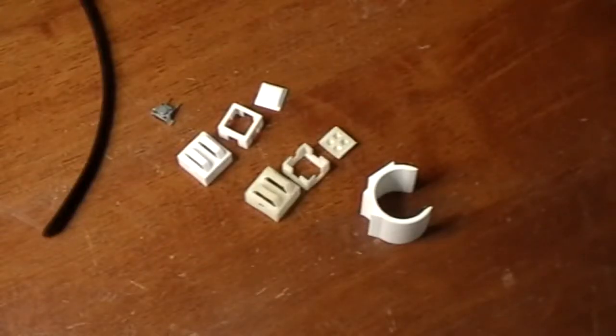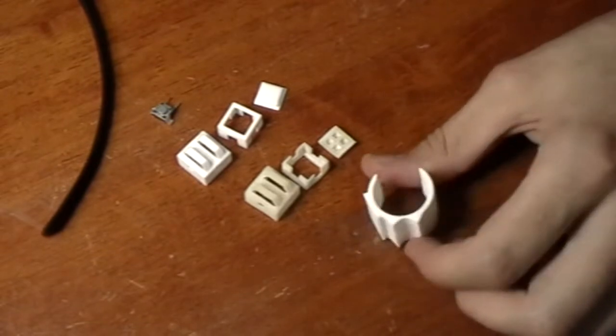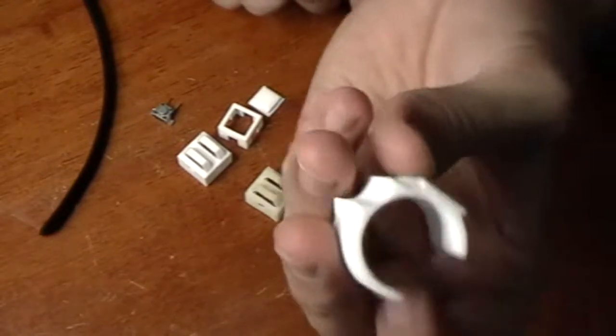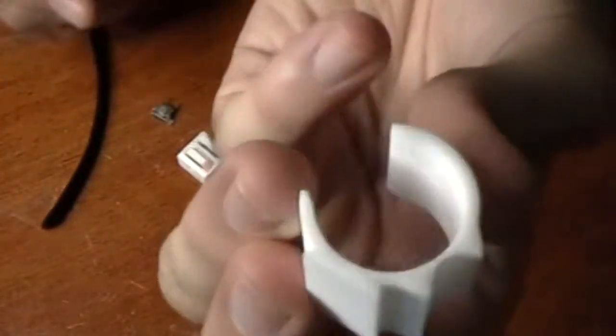So yesterday I got my Shapeways order in — ordered three prints. This is one of them; it's the most expensive one because it was the most dense. They charge by volume of plastic used.